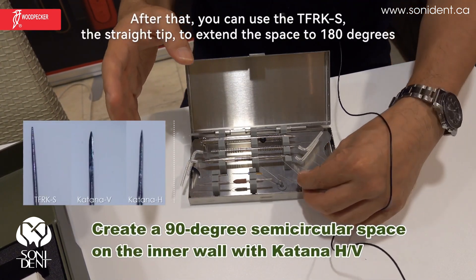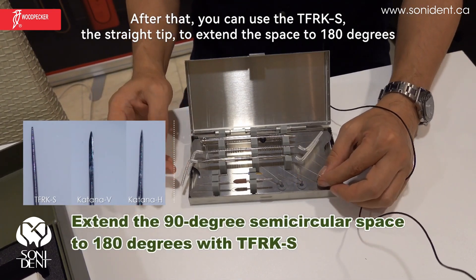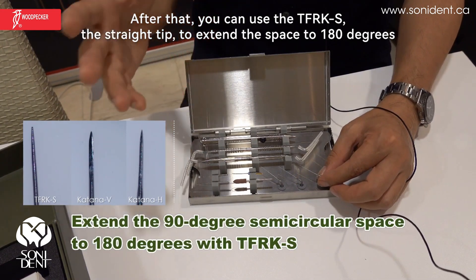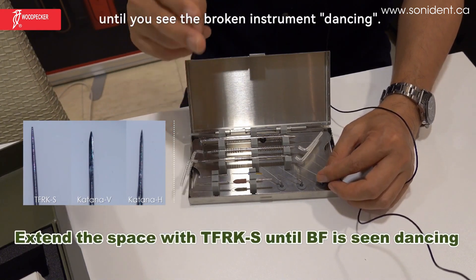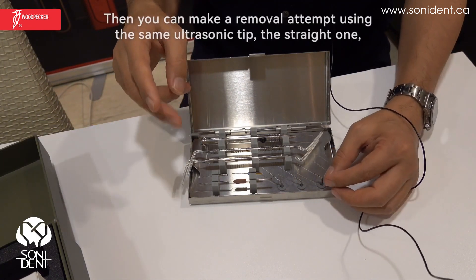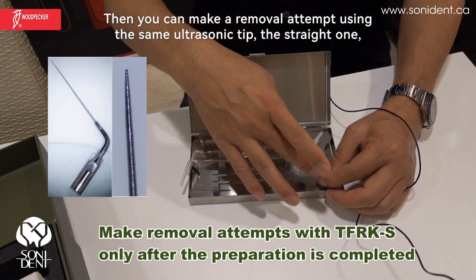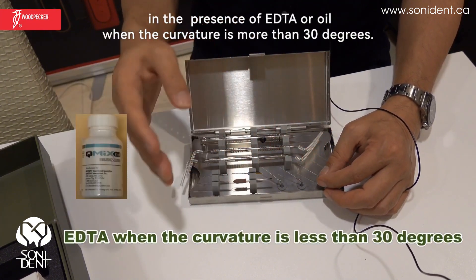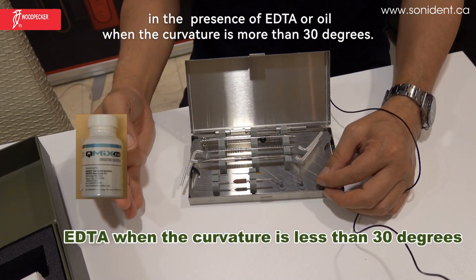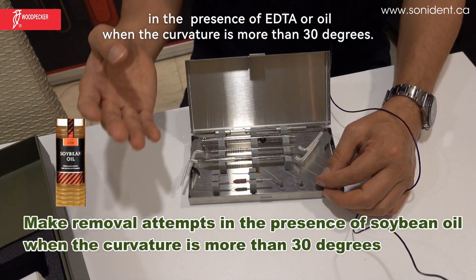After that, you can use the TFRKS straight tip to extend the space to 180 degrees until you see the broken instrument dancing. Then you can make a removal attempt using the same straight ultrasonic tip in the presence of EDTA or oil when the curvature is more than 30 degrees.